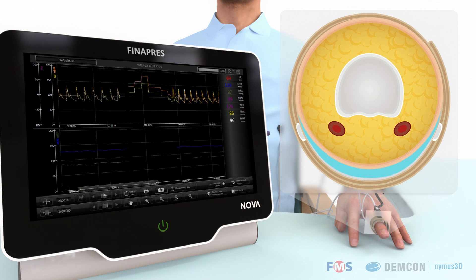Consequently, the pressure inside the cuff that is needed to maintain this equilibrium resembles the arterial blood pressure in the finger.